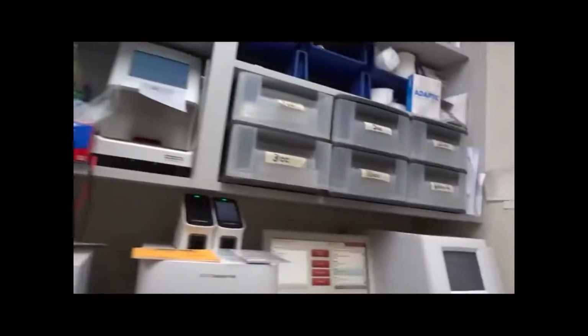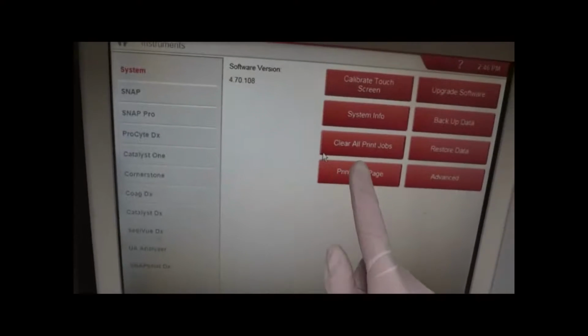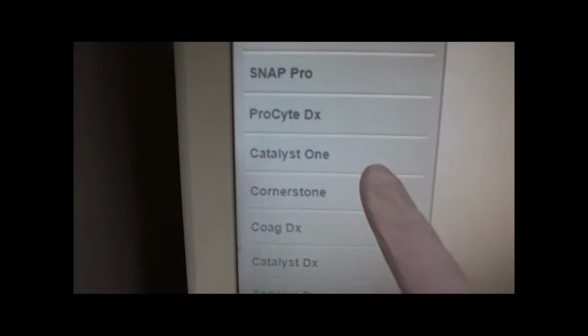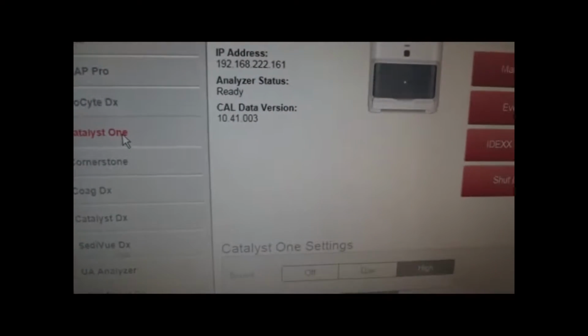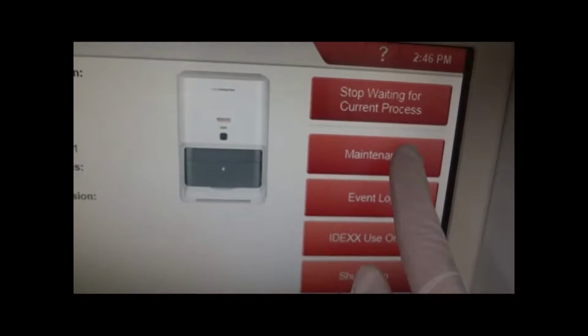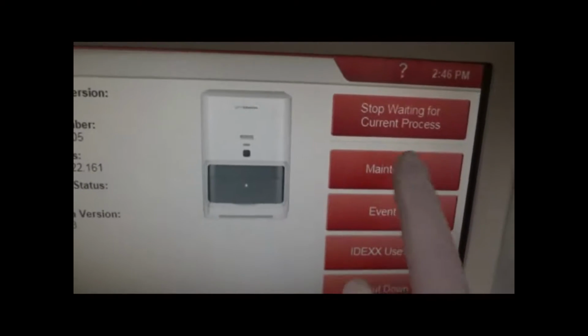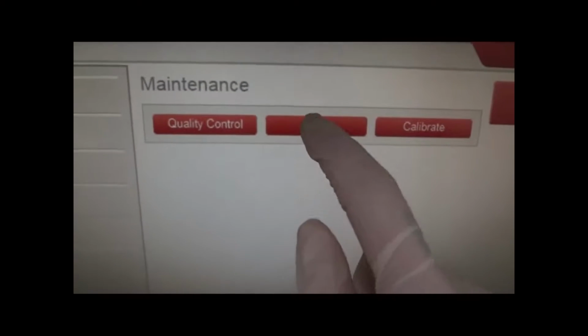First, we will be performing a routine maintenance cleaning on our Catalyst 1 machine. We will start on the home screen, select Instruments, the Catalyst 1, Maintenance. It's not really wanting to read me because of the gloves, and Clean.